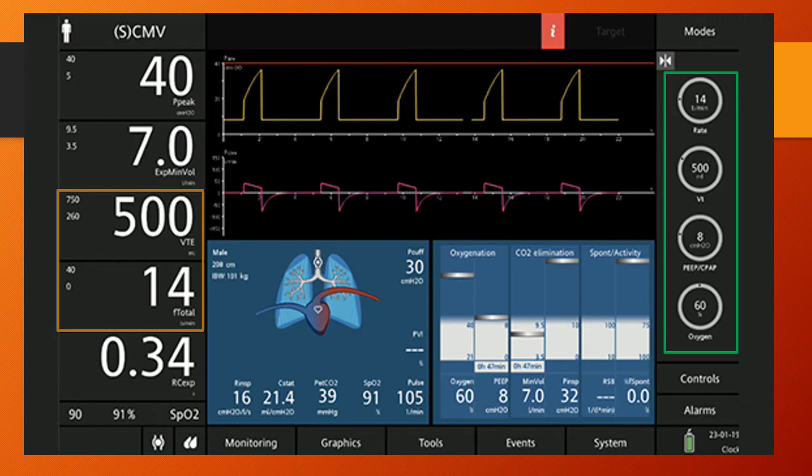That's saying that they are breathing 14 breaths per minute. So effectively, we're setting these minimums for them that they have to meet, that we think will help them to breathe better. And we're going to be looking at their gases, their ABGs and things like that, and seeing how that's worked. We're going to be doing our nursing assessment, seeing if this works out for them. That's our role as the nurse.